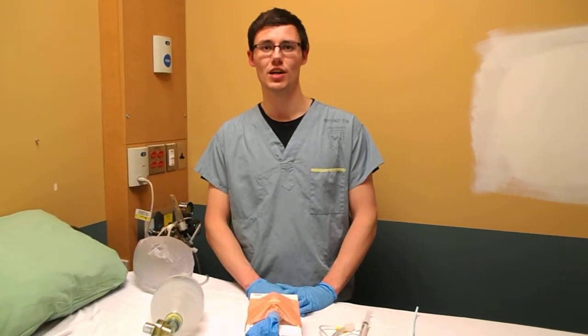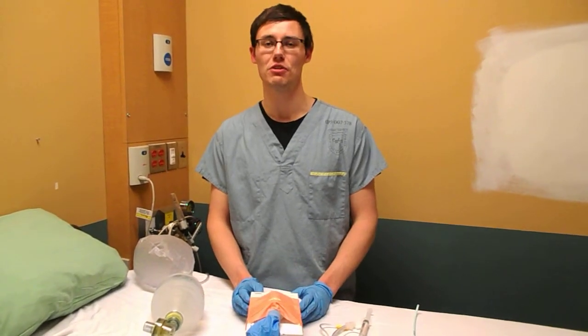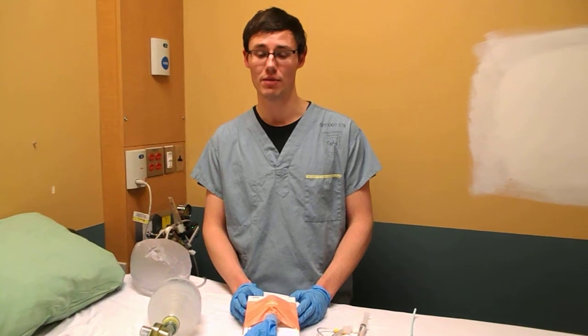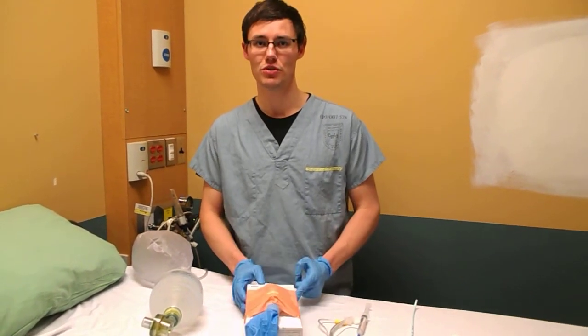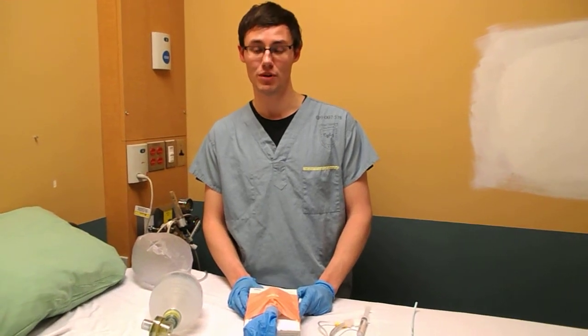Hey there, this is Chris Bond from the SockMob blog. Today I'm going to be showing you how to do a bougie-assisted cricothyroidotomy. First you need a Cricotrainer. If you don't know how to do this, look back to my other videos and I'll show you how to make one.